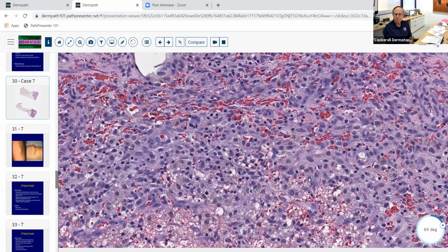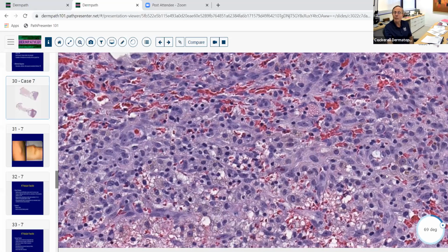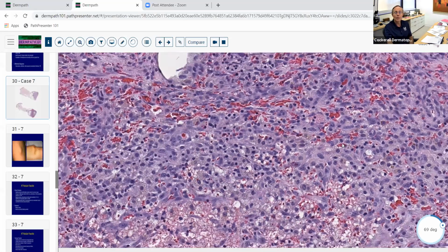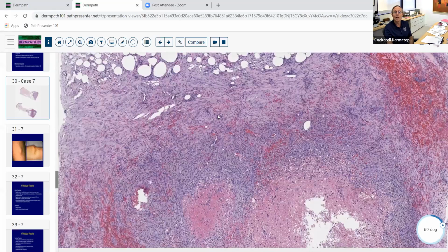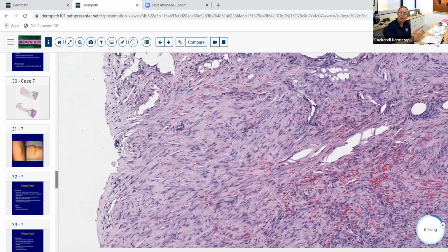And sometimes it sort of proliferates and doesn't go away quickly enough. And that's when somebody takes a biopsy of it and it looks like this. And then here you see a lot more histiocytes. You can see it kind of looks like a dermatofibroma here in this field. In other areas, it looks more spindle, like over here. So, you get a late stage dermatofibroma, it becomes more spindle. Early on, it's got histiocytes and fibroblasts and extravasated erythrocytes. So it's really the same type of entity as a dermatofibroma, just like what we saw before.